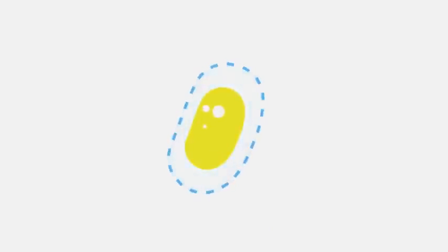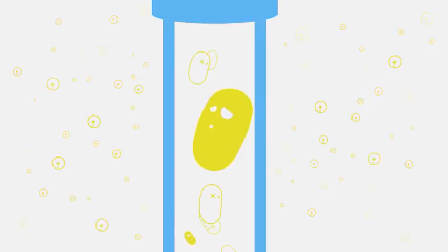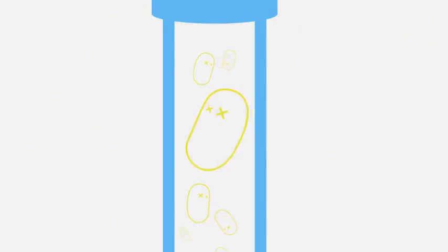Because this type of spore is so highly resistant to disinfection and sterilization, it is the perfect candidate to go inside of a BI. Under adverse conditions, this little guy is a spore former. That is, it is able to go dormant and form a shell which increases its resistance to sterilization and disinfection processes. Testing to ensure this tough bug is dead provides the assurance that pathogenic microorganisms have been destroyed.